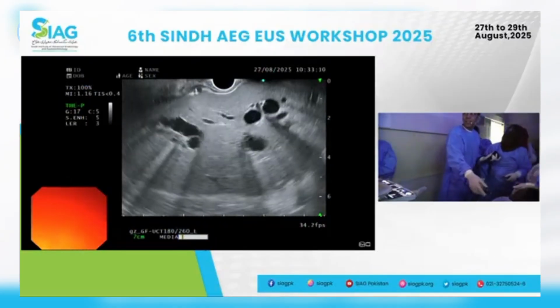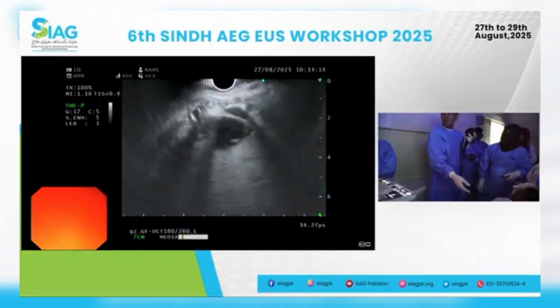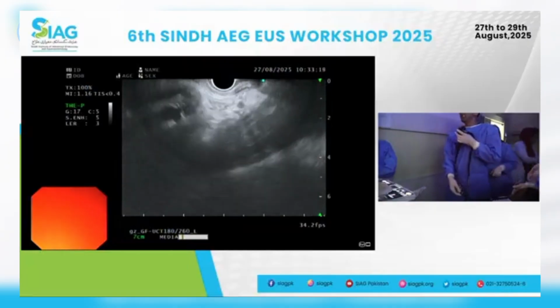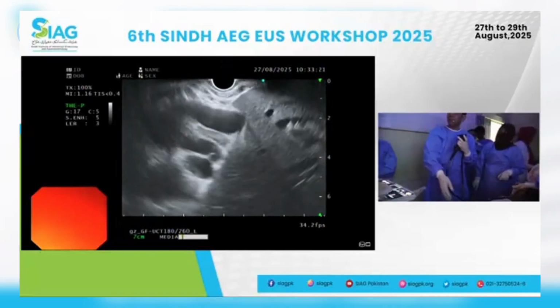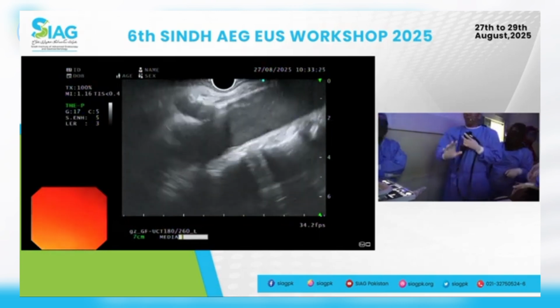The majority of the liver is on this side. I've got a maximum view. All I'm doing with my right hand is supporting. If this doesn't work, I'm going to rotate all the way to the right. What has happened is obviously I've landed up possibly onto the gas already there. Let me just see if I can go back and there's the aorta.